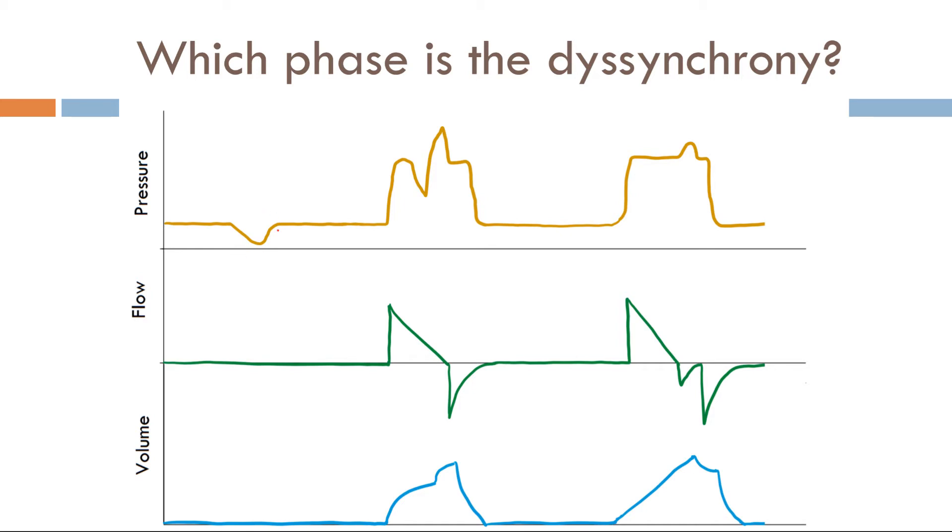There's a negative deflection right here in the pressure scalar. What does that mean? A negative deflection in the pressure scalar means inspiration. Now the patient is inspiring, but there's no breath being triggered. This is an issue with trigger. Therefore, this is a trigger dyssynchrony.